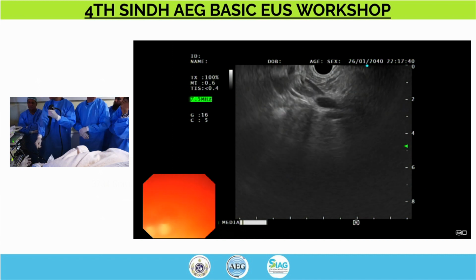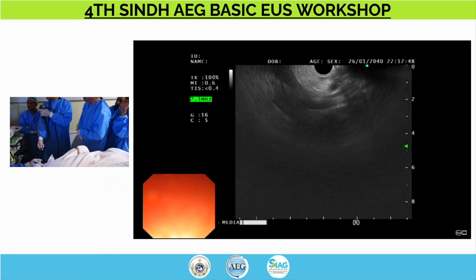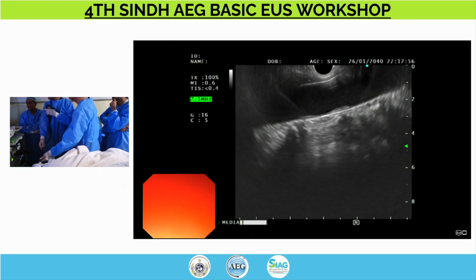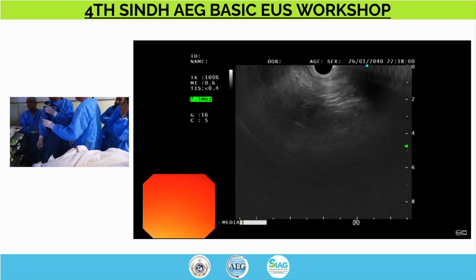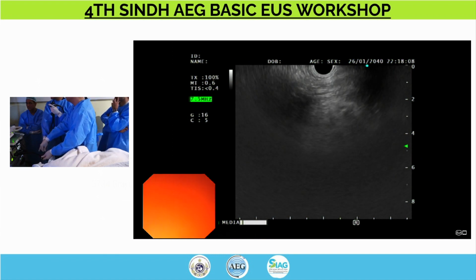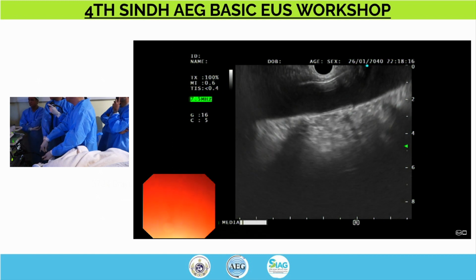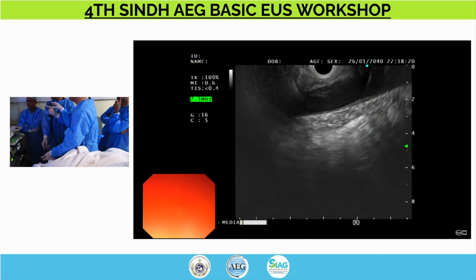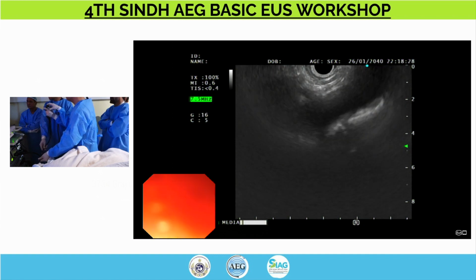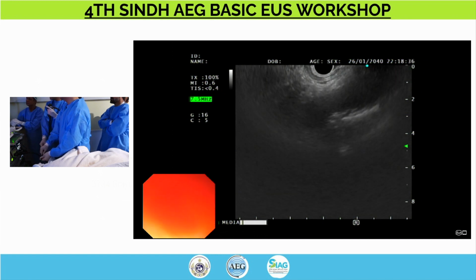So once again, go back to the aorta. Once again go back to the aorta. No air. Look, it is 50, so we need to pull back to 40. The aorta has come straight. Aorta to celiac artery. Aorta to celiac, just gently push along. Slide, gentle push. There is your celiac artery. Big wheel slightly away from you. And now follow the celiac artery, big wheel slightly. Yes sir. So from the aorta you jumped to the next reference point, the celiac, under your transducer.